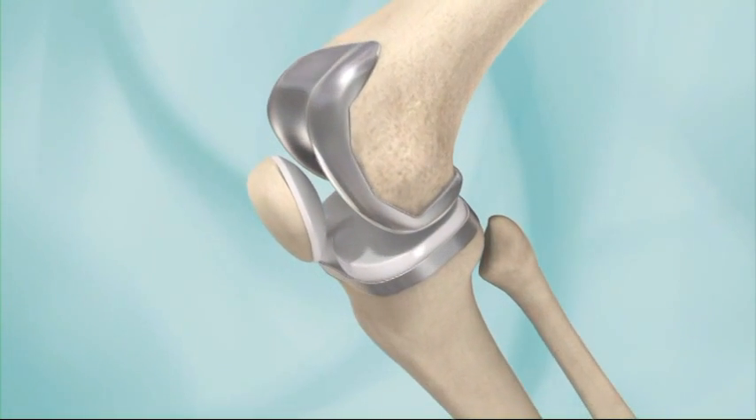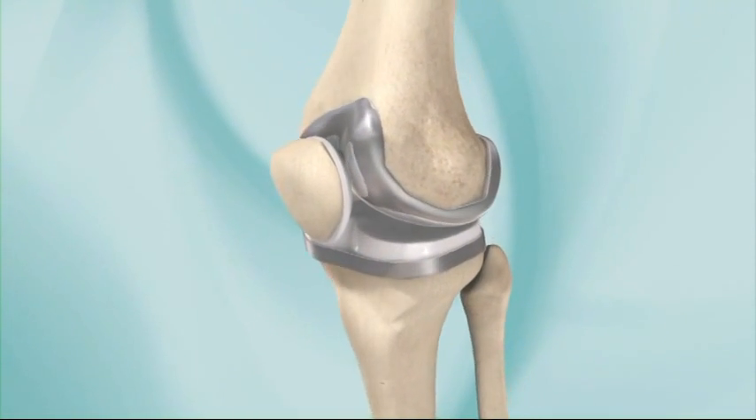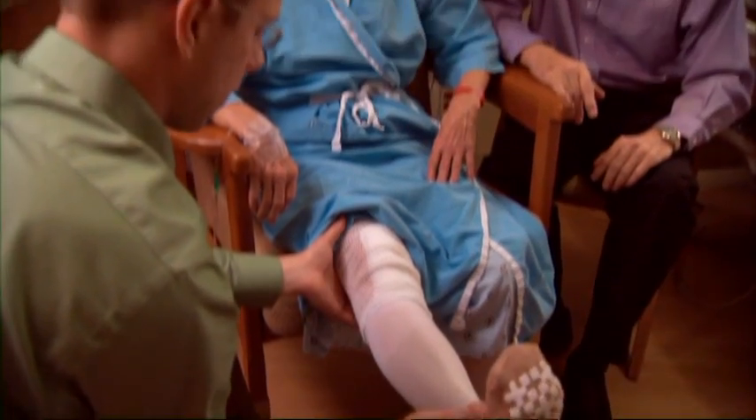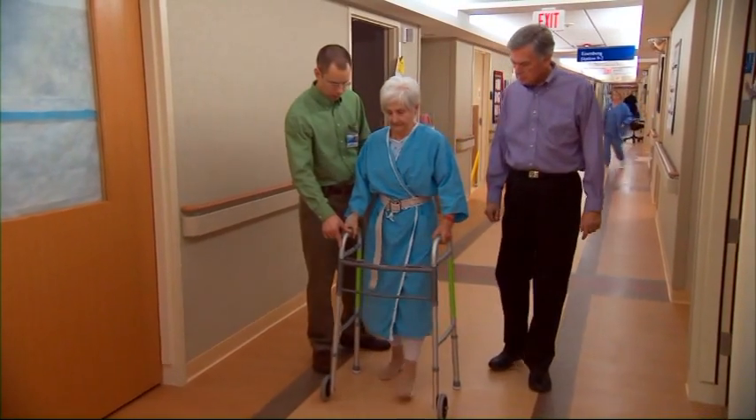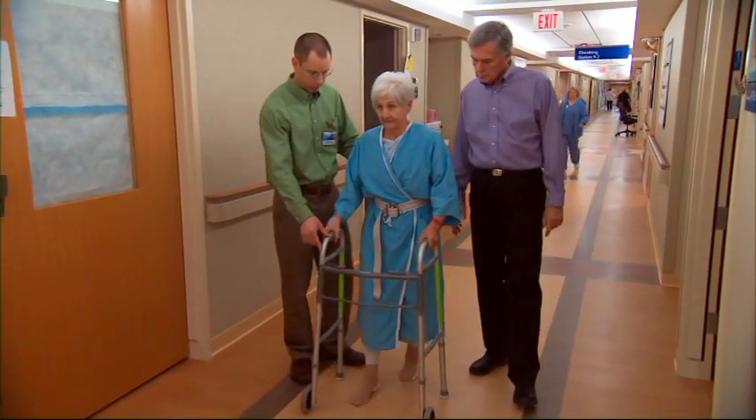These parts are designed to help the knee move freely and without pain. You will receive instructions on exercises, how to get in and out of bed and a chair, how to use a walker or crutches, how much weight you can put on your leg, and more.